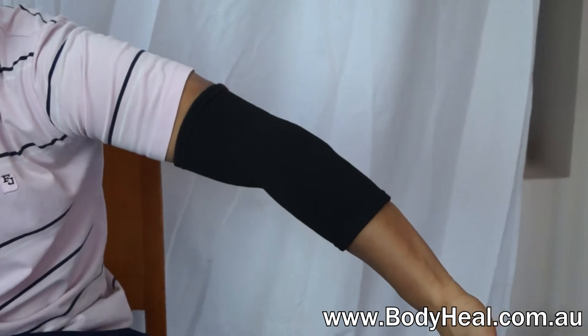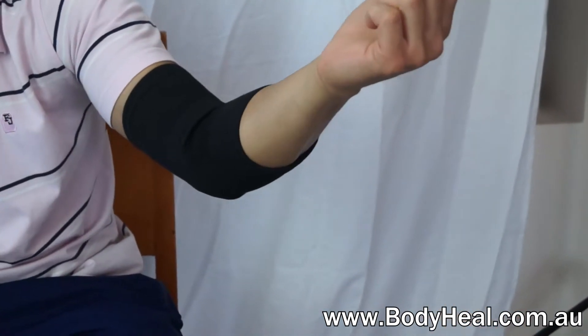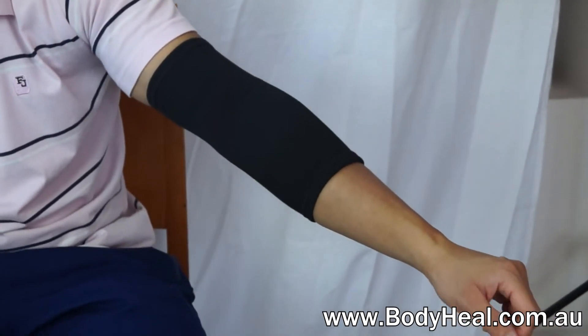It's a great therapeutic option for minor elbow pain related to conditions like tendinitis or tennis elbow. Get yours today at BodyHeal.com.au.